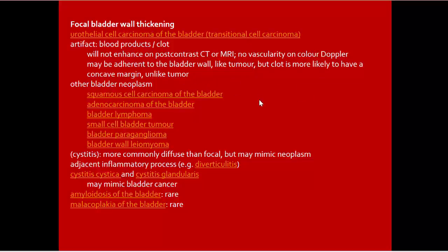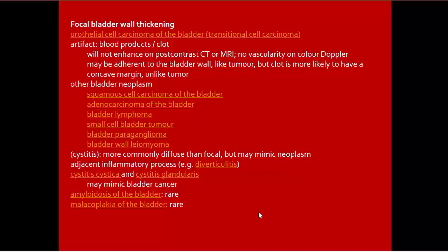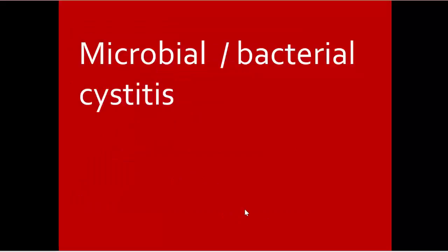Other bladder neoplasms causing focal bladder wall thickening include squamous cell carcinoma, adenocarcinoma, bladder lymphoma, small cell bladder tumor, bladder paraganglioma, and leiomyoma. Cystitis is more commonly diffuse than focal, but may mimic neoplasm and adjacent inflammatory processes like diverticulitis. Cystitis cystica and cystitis glandularis may mimic bladder cancer. Amyloidosis of the bladder and malacoplakia are also in the differential.